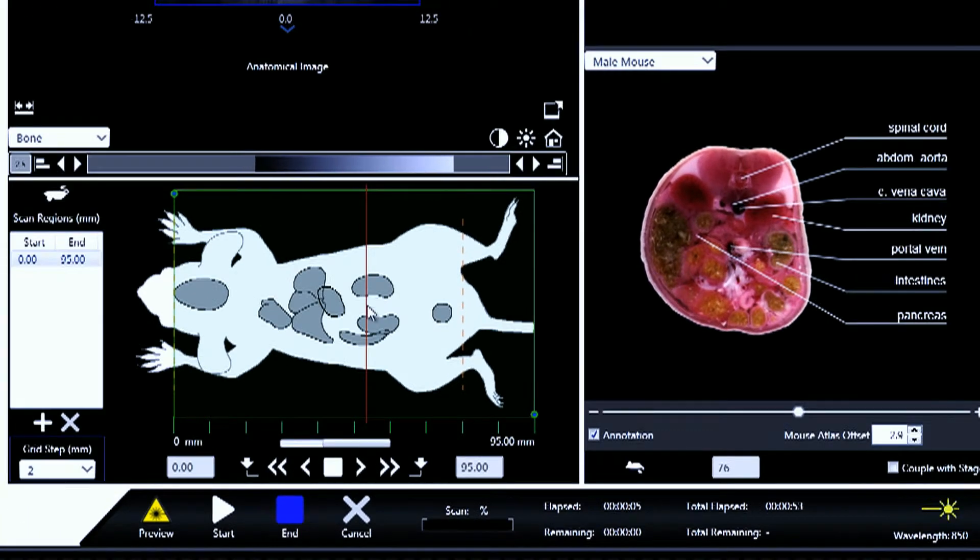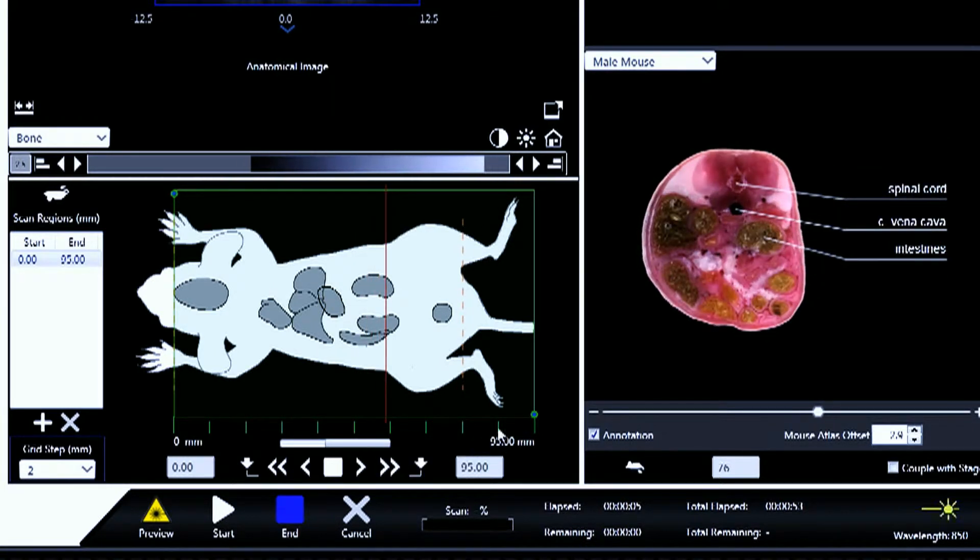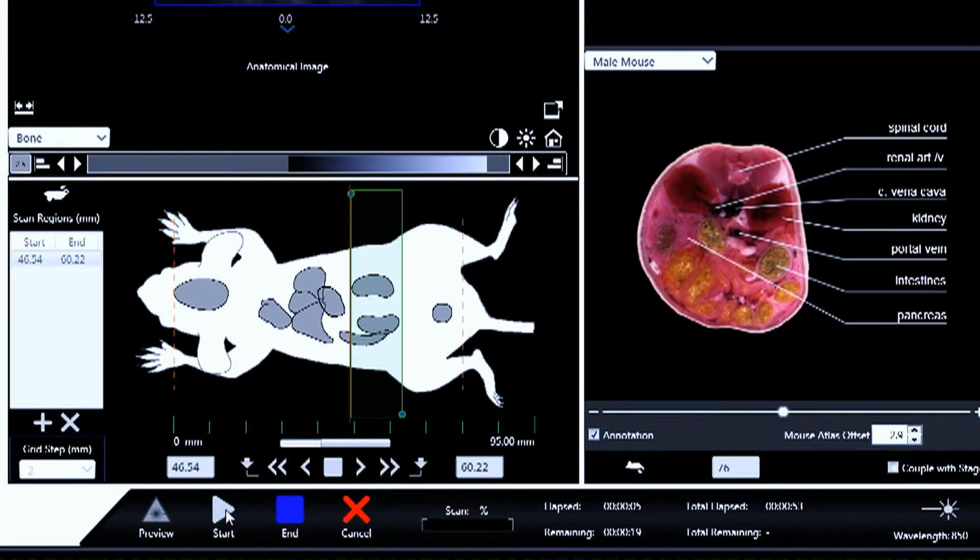Before starting image acquisition, the user defines the scan region by clicking on the desired anatomy or through use of the stage controls. Users can set individual or multiple scan regions. The user then starts the image acquisition.